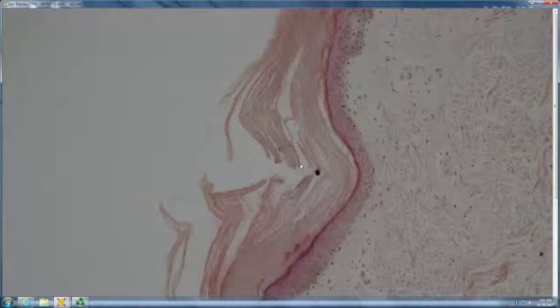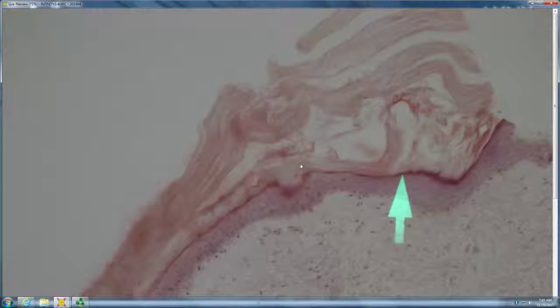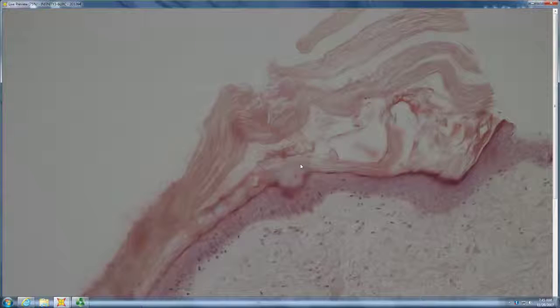So what if we were to say that that's a preserved granular layer and you have a lamellar hyperkeratosis? Looking at your epidermis, is this more a retention hyperkeratosis or a hyperproliferative hyperkeratosis? I think the latter. In hyperproliferative, usually you have proliferation of the epithelium. In a retention, your epithelium looks normal, boring, flat, thin.